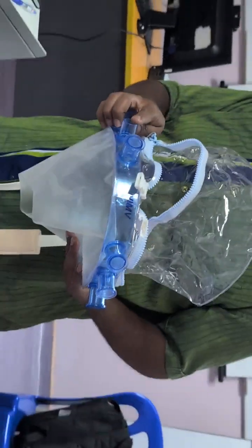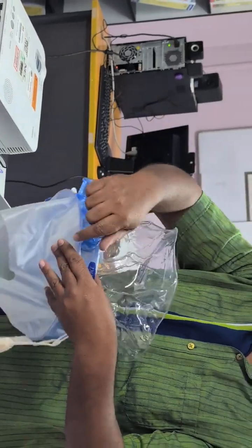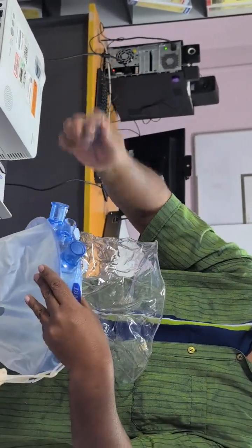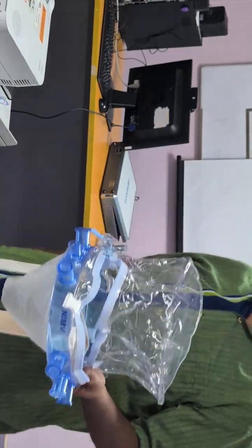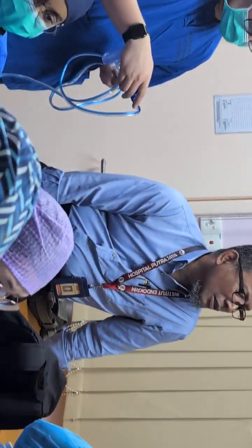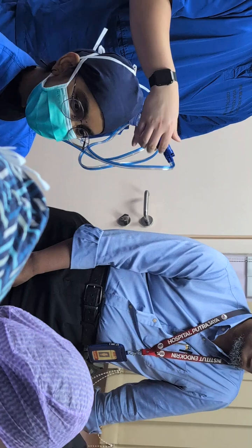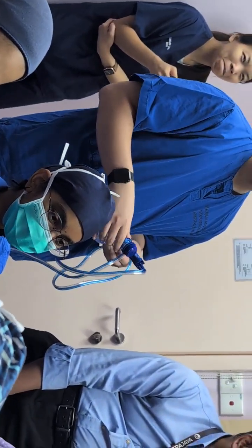What is this? The port, there's 6 ports there. So if you use just one, all the rest are closed. So you see, only one is open, the rest is closed. So if you want, you can open it. If you want to put any net or anything, everything is already here. Single use. Okay. So the thing is, it should be single use, but we reuse it. Every product is like that. Yes, because it's expensive.